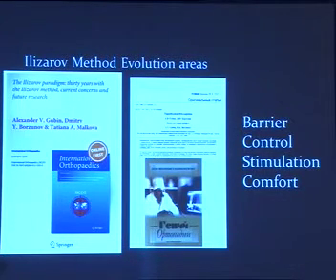In the future we will control all our movements, all our changes in our construct using the internet, using automatic movements, automatic distractors. I think it will be so, and it may be quite popular and easy in India because you have the best programmers, the best software in the world. So you can be very, very active in this field, to be the first.